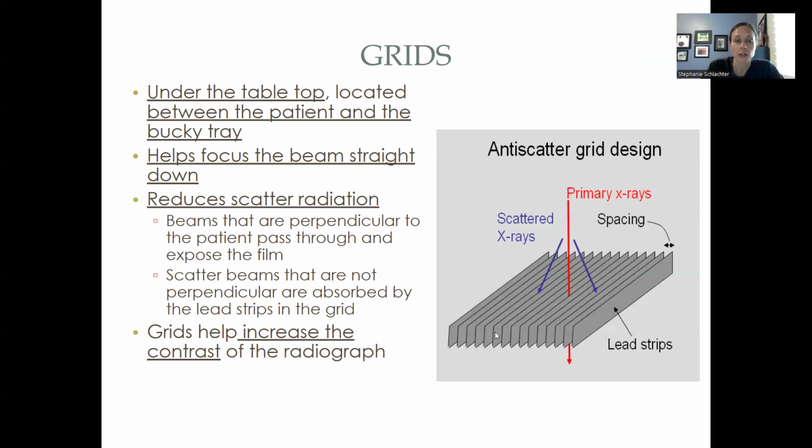Also, the grid is going to help us increase contrast. Okay. Because again, we're only going to get these quality X-rays that are kind of true to what went through the patient. The scatter is going to add to the overall density, which then negatively impacts our contrast. So grids increase contrast because it's taking out that scatter radiation.